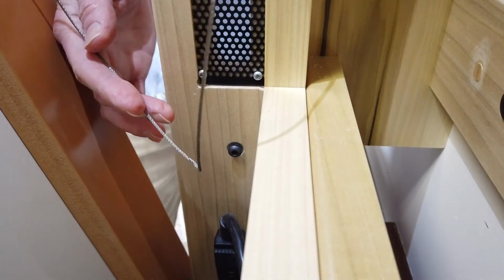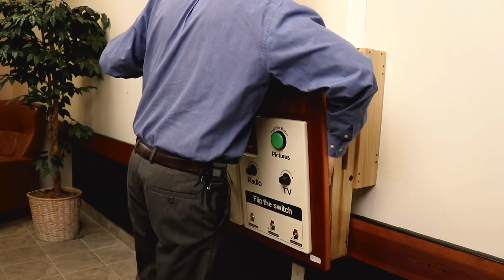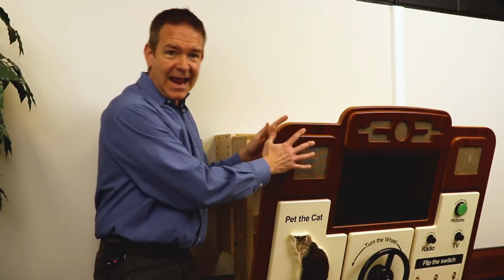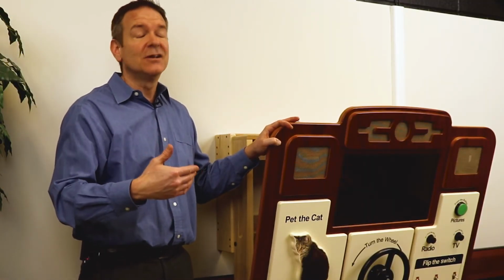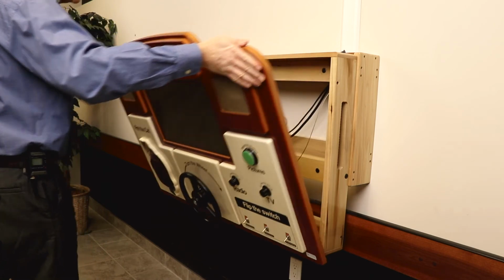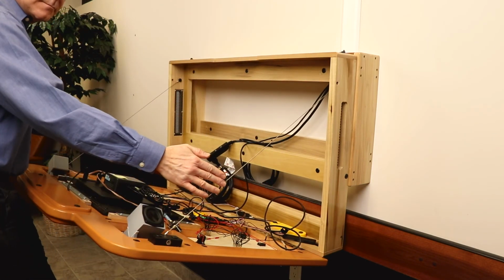Now, let's detach the other side. Remember, we'll have to be careful. Like before, we don't want the front panel dropping quickly. So keep a hand on it, or if you have someone there that can help you while you detach, that would help as well. Now we can gently lower the front panel as it's on hinges, as far as it will go, and it will stop when the support cables are fully extended.